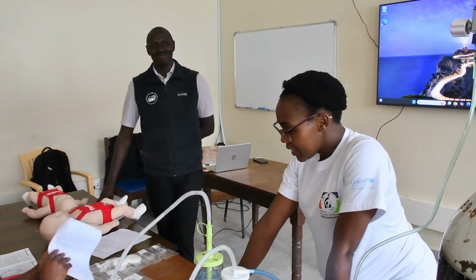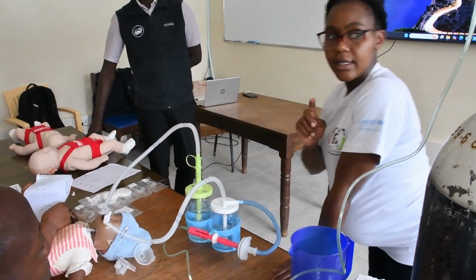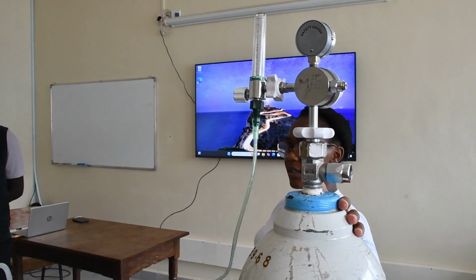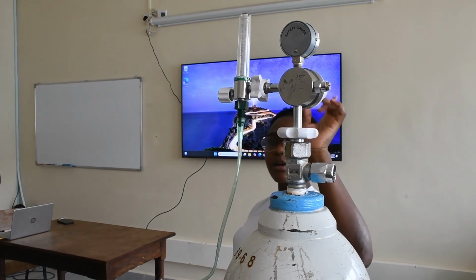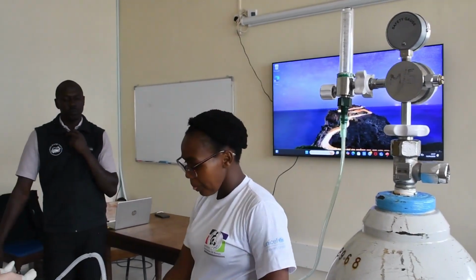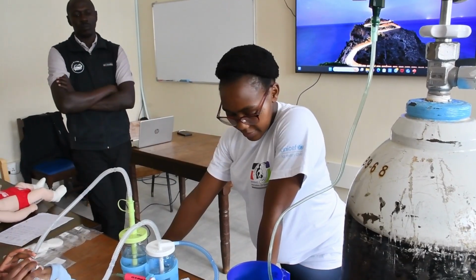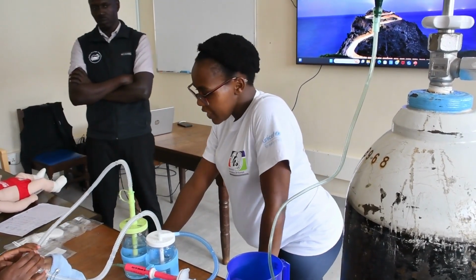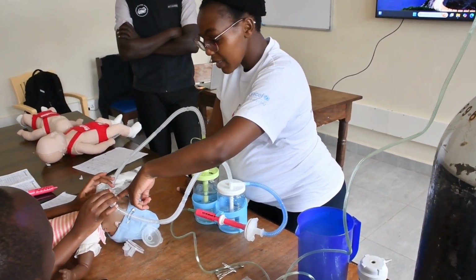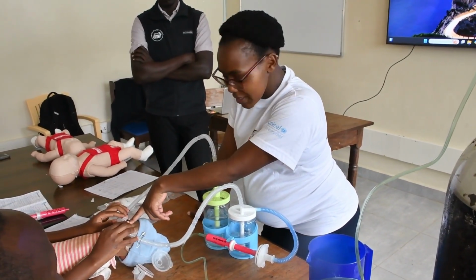And then you also monitor the system. The other thing is you should ensure that your oxygen is adequate. So you check, if you are using a cylinder, whether it has enough oxygen to support the pressure. And then to the patient now, you check the position of the prongs.